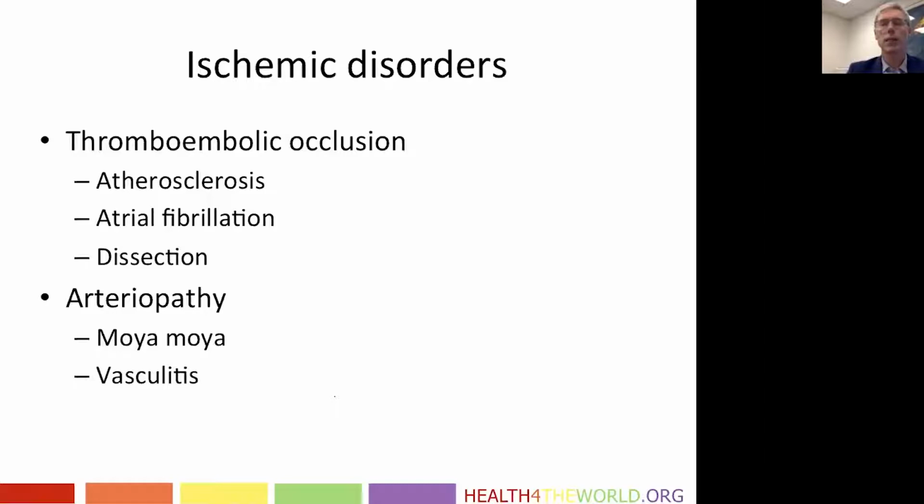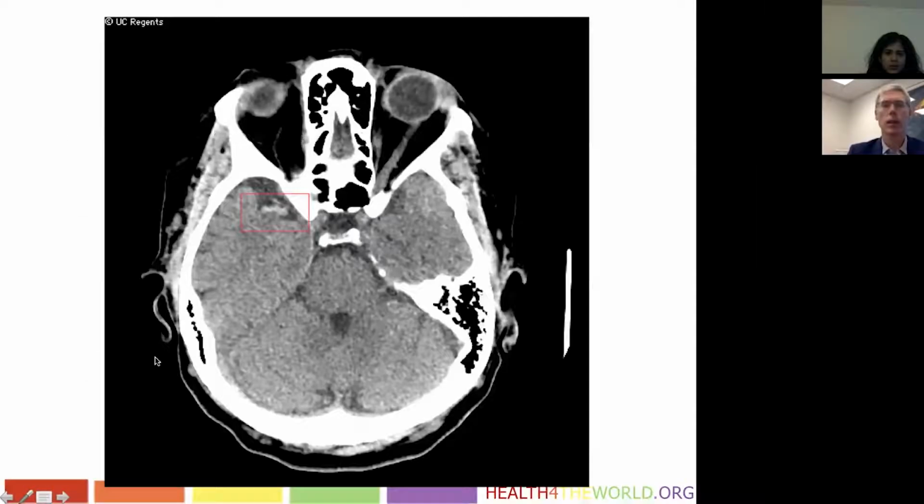This is not as much something that we have to deal with from an interventional standpoint. Our role in these cases really is diagnostic, to make a determination as to the physiology of the flow to the brain, but also sometimes making the diagnosis. But we do little in terms of the therapies for these particular types of patients. So let's show some cases.